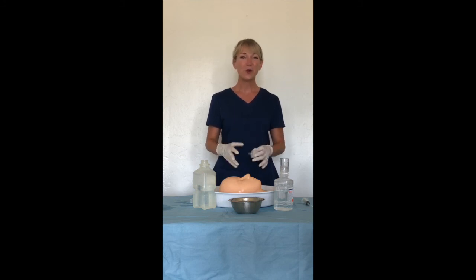The second problem with this method is that the holes that were made with this needle are so small that it's difficult to generate 8 pounds of pressure. And again, there's no protection from splashback with this method. So the harder someone squeezes, the more PSI you may get, but the bigger the mess you're likely to make. So most of you won't squeeze the bottle hard enough to generate close to 8 pounds of pressure because there's no protection from splashback. You can imagine that if this were a bloody wound, what a mess I would have made, and how risky it would have been for you, the healthcare worker, to irrigate it without protection.